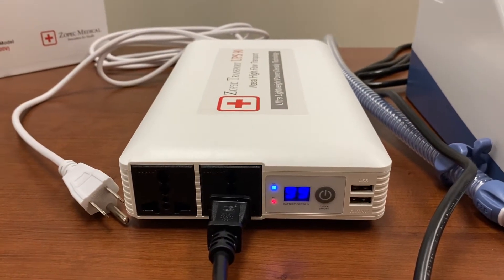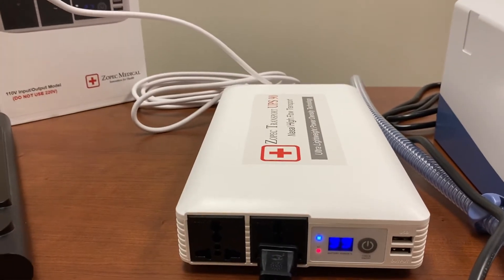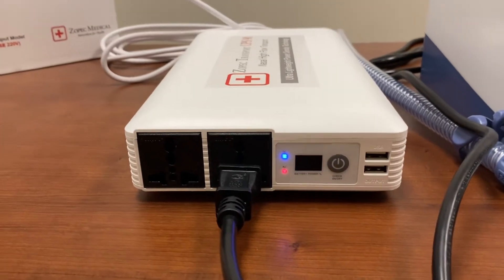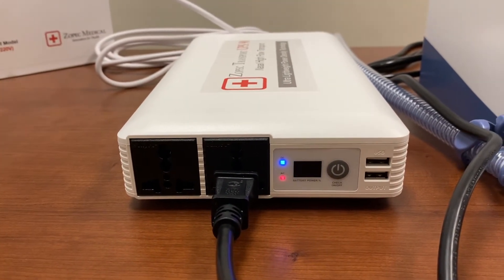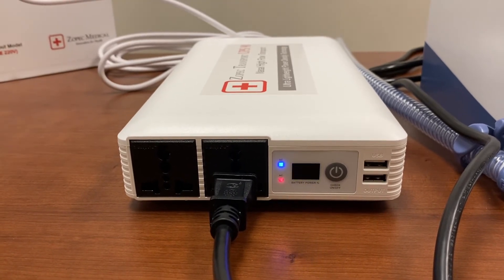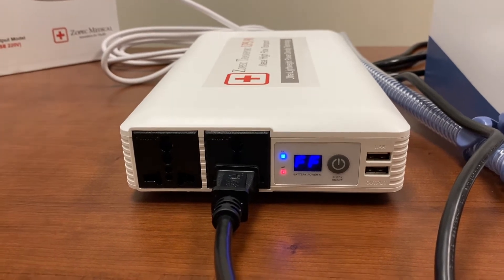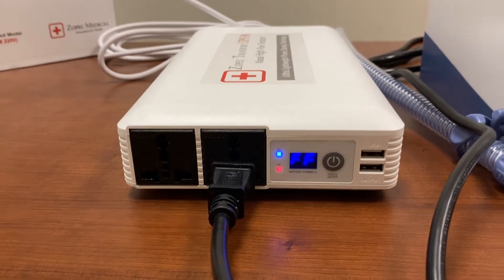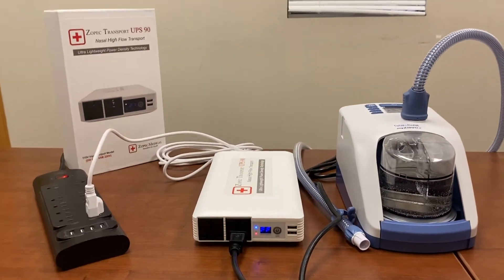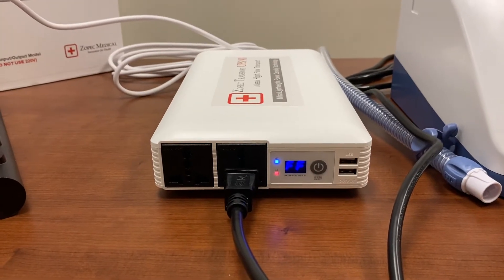Before transport, normally the UPS is plugged in and the battery stays at 100% full. Before transport, it should be running the AirVolt 2 and also staying at 100%.